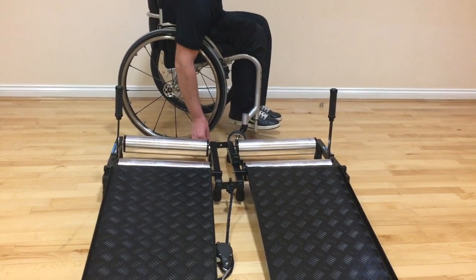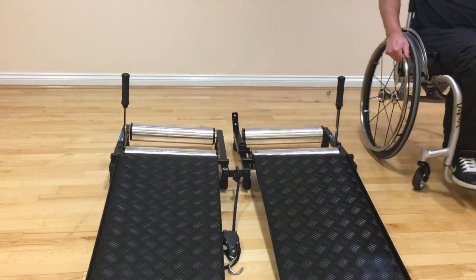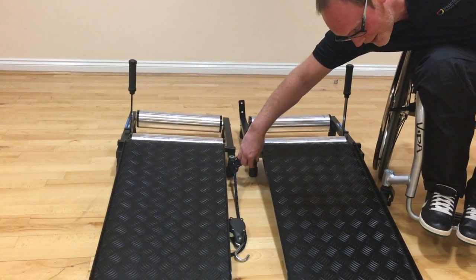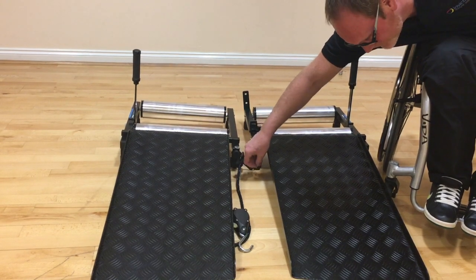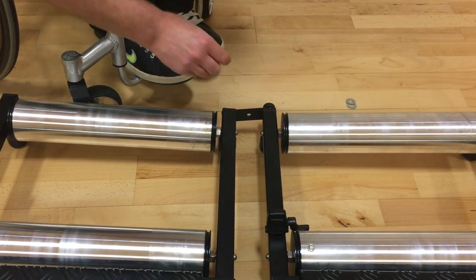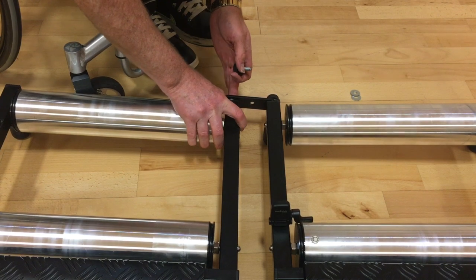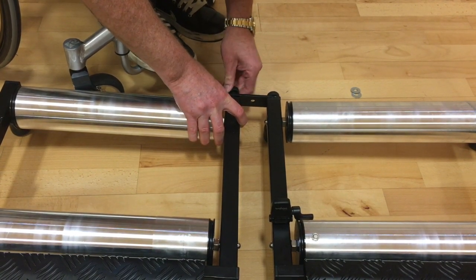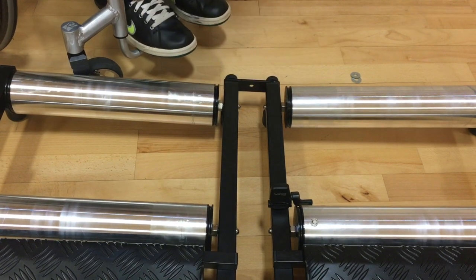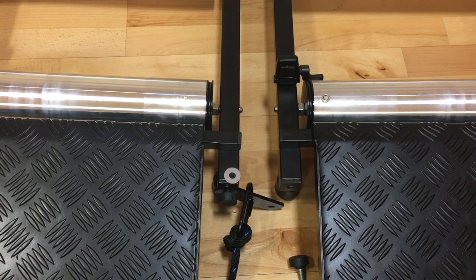Remove one of the thumb nuts from the back of the trainer, then wheel round to the front of the trainer and remove it from the front on the opposite side. Having removed the thumb nuts from the back of the strap, we now need to put the washer behind the strap and replace the thumb nuts. Then wheel round to the front of the trainer and do exactly the same on the front.